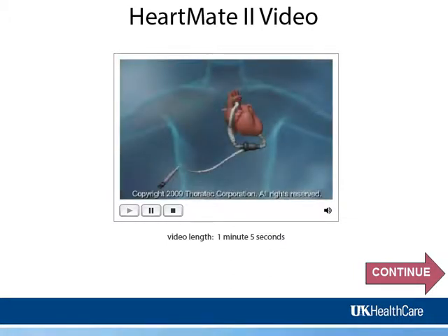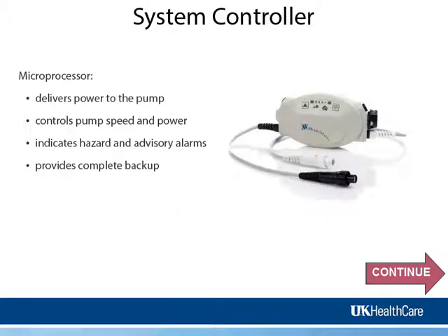The HeartMate 2 is a small... The system controller has 2 controller boards, one for the primary system and one for complete backup system operation. It has automatic event recording and data logging capabilities. It records and stores pump parameters during all alarm conditions.